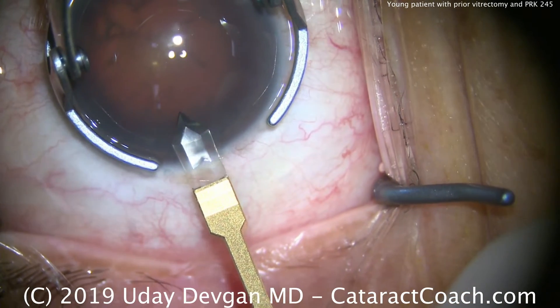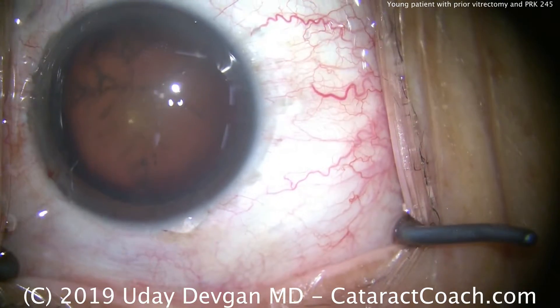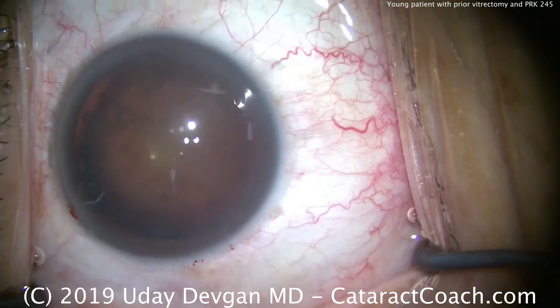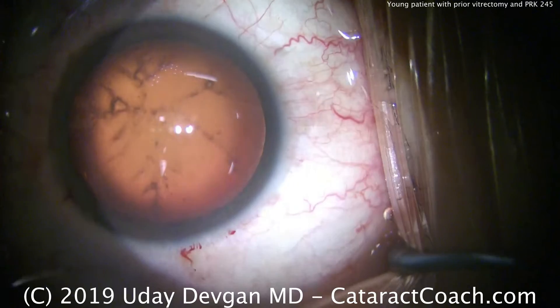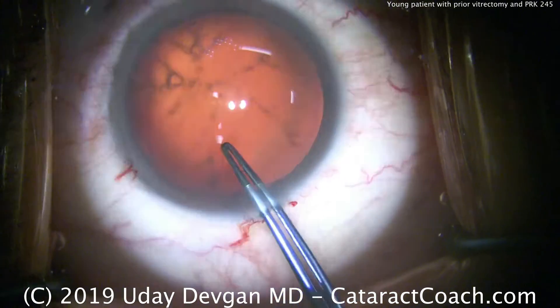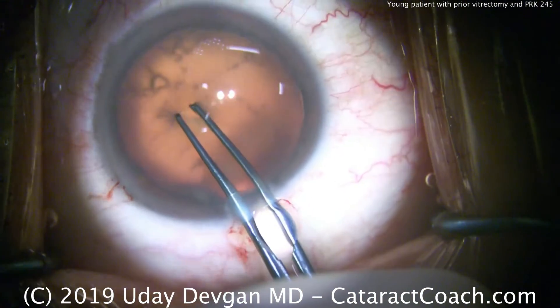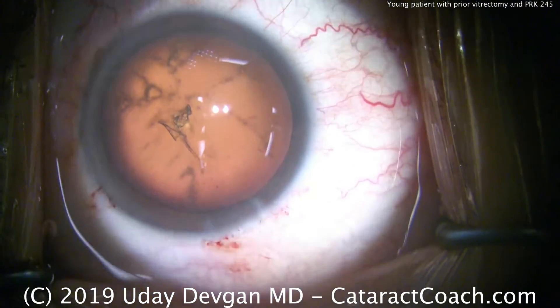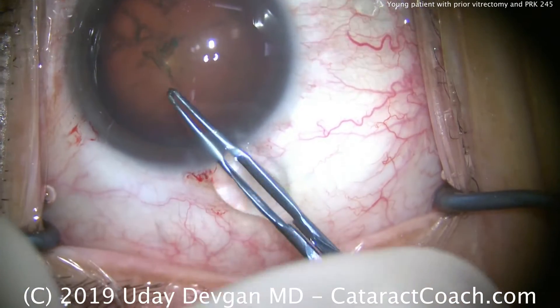We make a small entrance using the diamond keratome — a smaller than normal phaco incision so we can use the smaller sleeve. This is a very large eye, long axial length, very large white-to-white measurement. The patient had about 10 or 11 diopters of myopia, first treated with PRK, and then many years later had a retinal detachment requiring vitrectomy, followed by a second vitrectomy to remove a macular membrane.